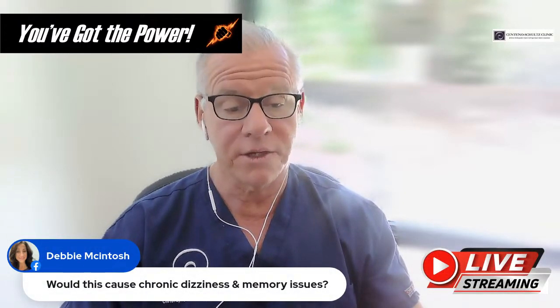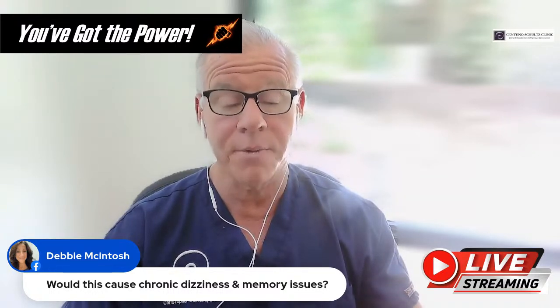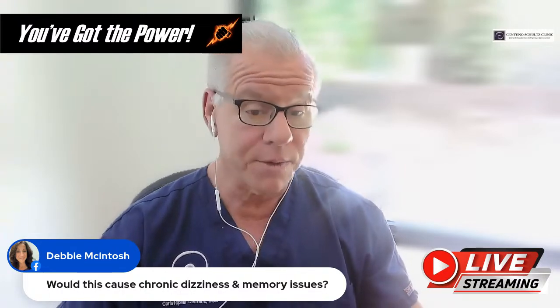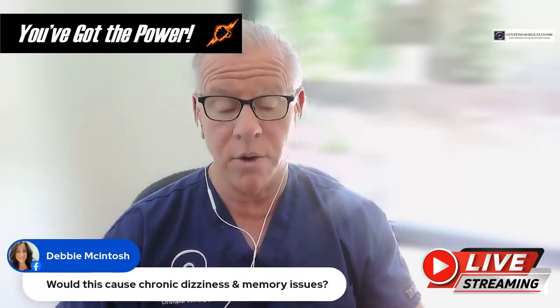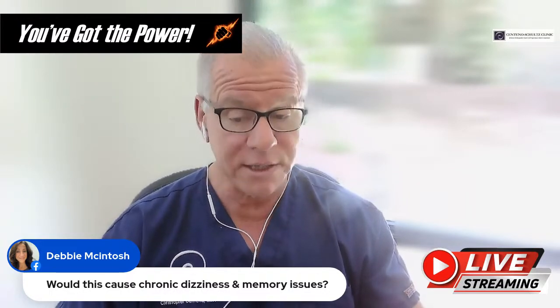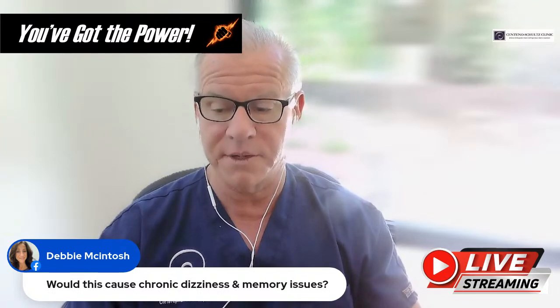Debbie, would this cause chronic dizziness and memory issues? Upper cervical problems, like the one we just looked at on DMX or craniocervical instability, can cause chronic dizziness and memory issues or, quote, brain fog, among other symptoms.